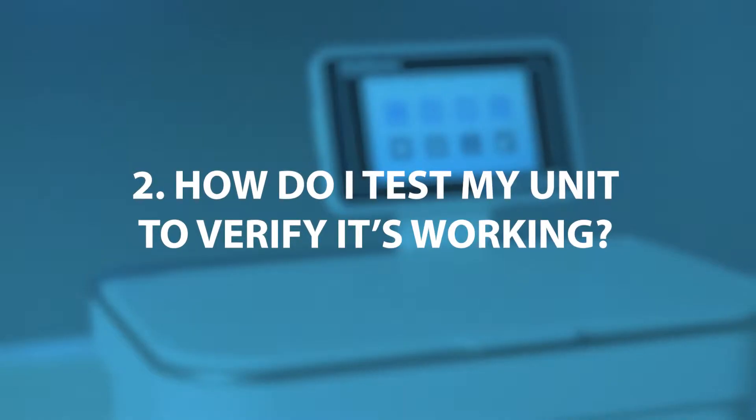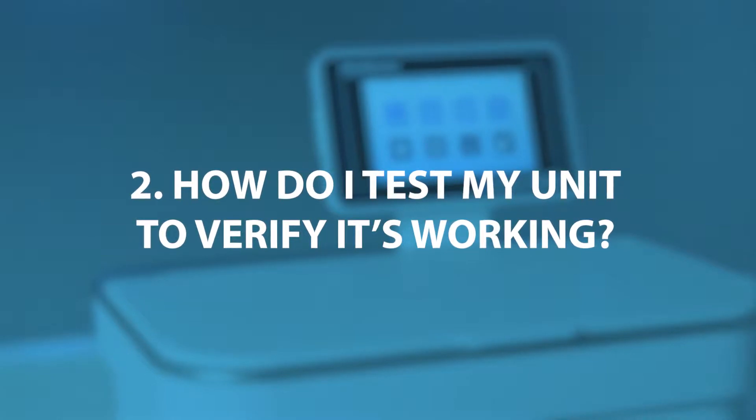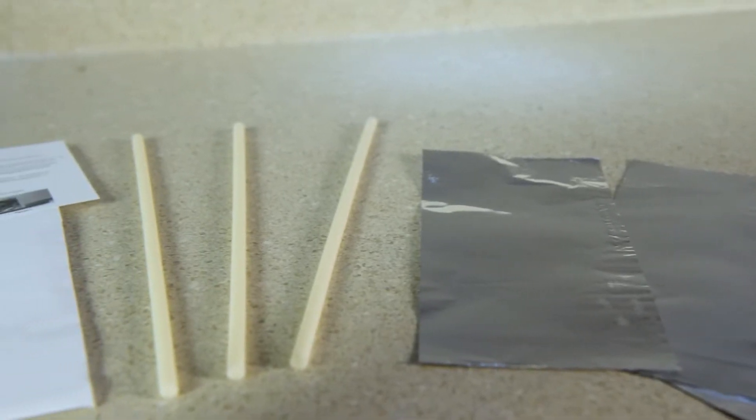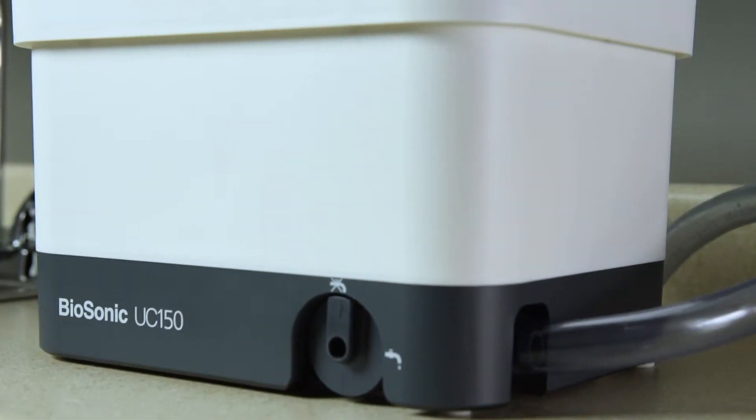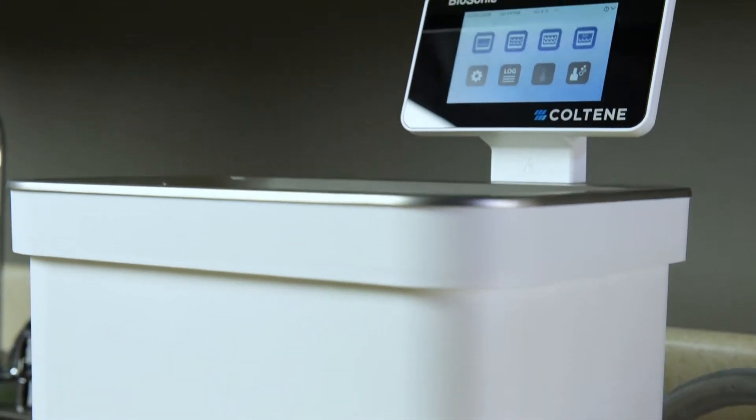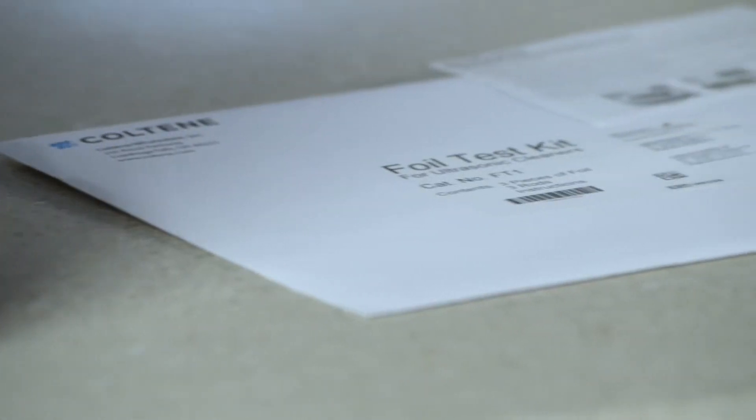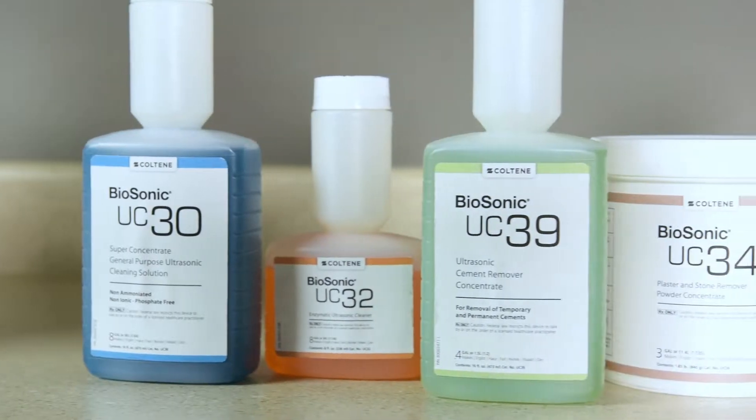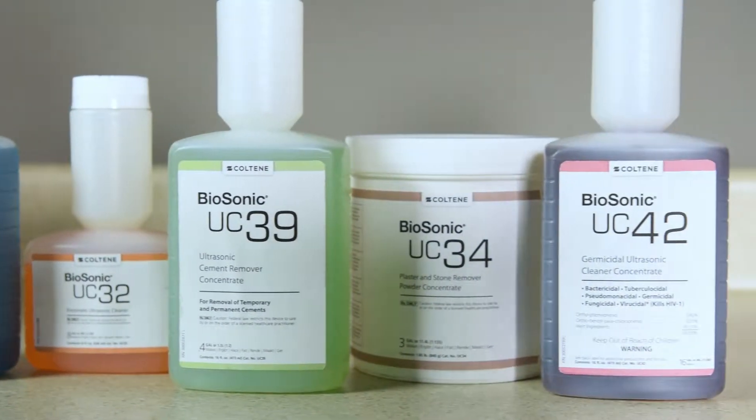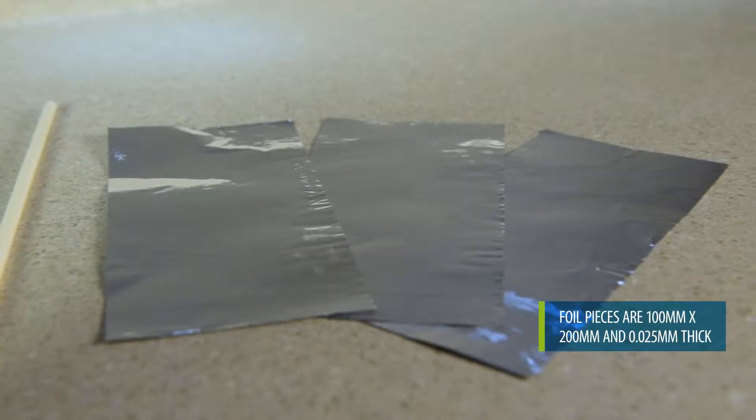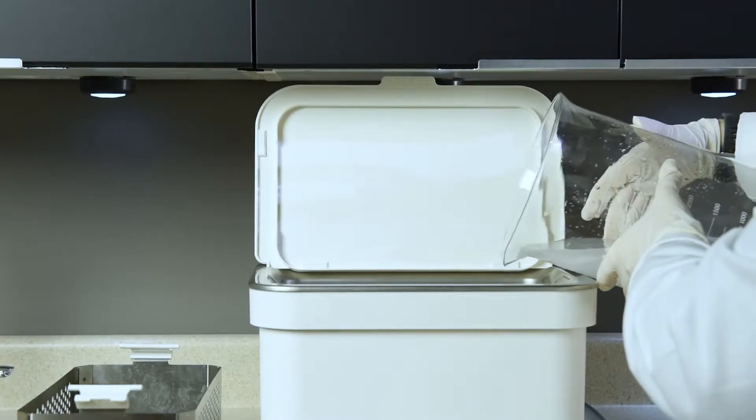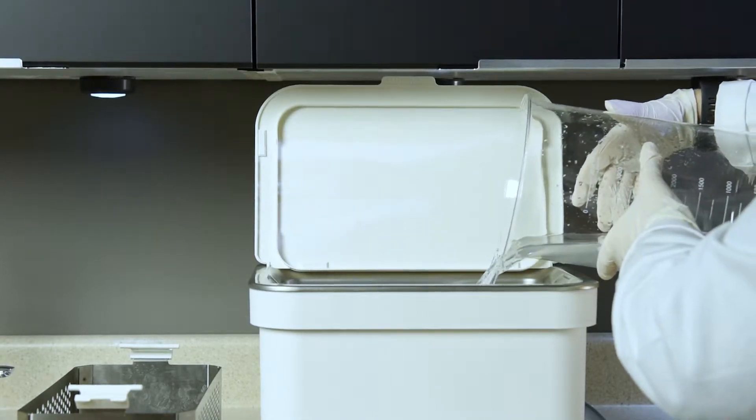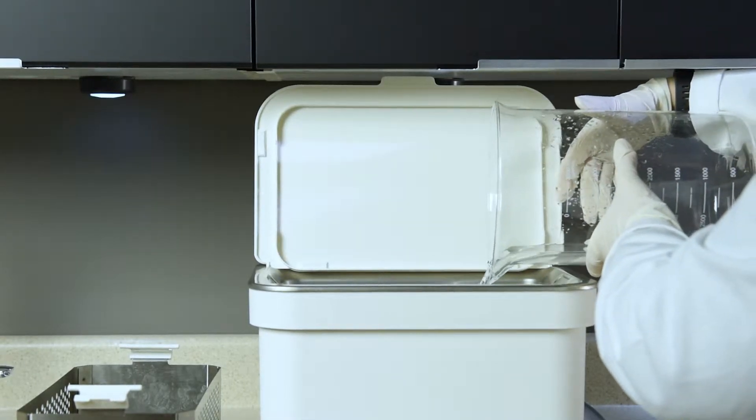How do I test my unit to verify it's working? In order to test your ultrasonic cleaning unit, you'll need to perform a foil test. To perform the foil test, you'll need your Biosonic UC150, Foil Test Kit FT1 and any Biosonic solution. If you don't have the FT1 test kit, you can use three strips of regular weight aluminum foil. First, prepare a fresh tank of cleaning solution according to the manufacturer's directions.